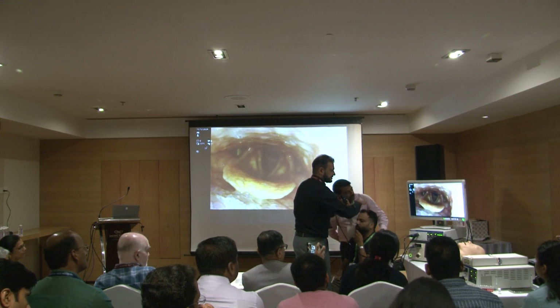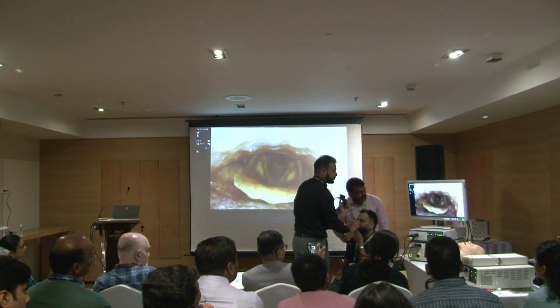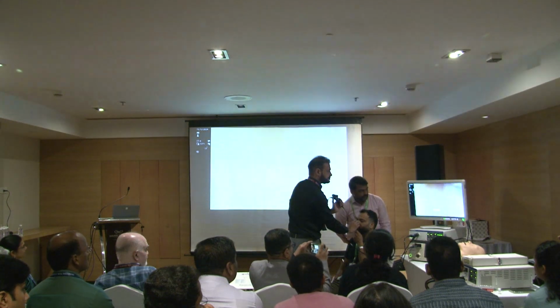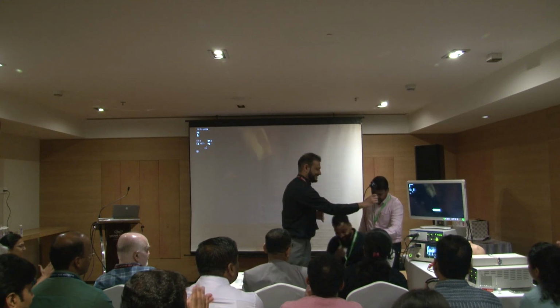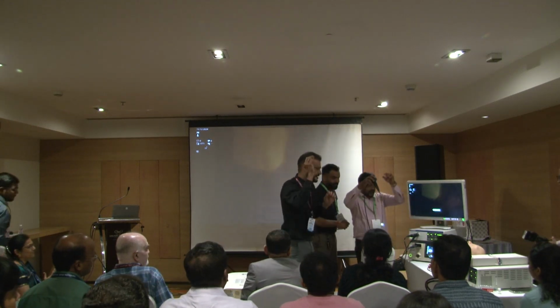At this stage, I will ask him to record the video, I remove the scope and then analyze. Shall I remove the scope, sir? Yeah. I remove the scope. You should thank him because without spray he has completely cooperated well. And you should thank me for my skill also. Okay.